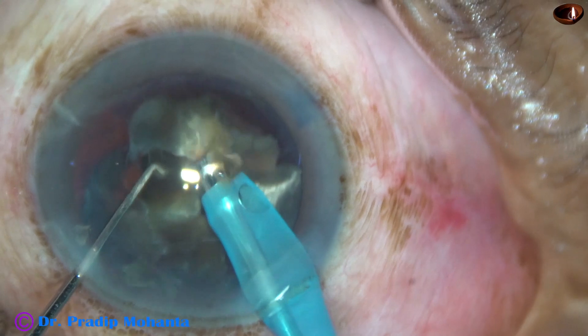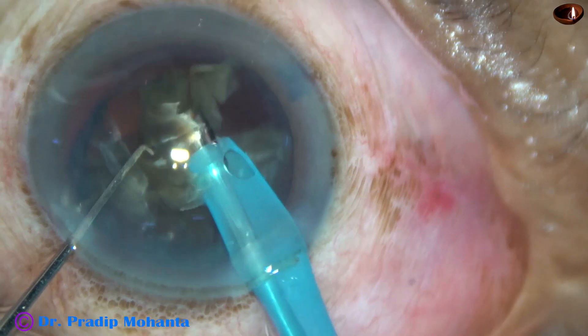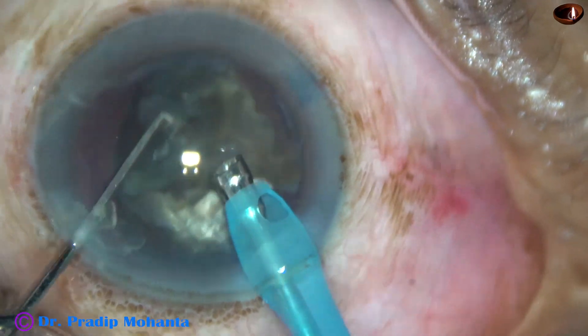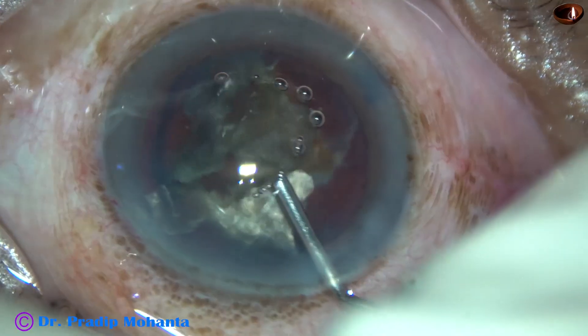One more thing to note: no small pieces are running here and there, and it is not hitting the posterior corneal surface — not hitting the back of the cornea.